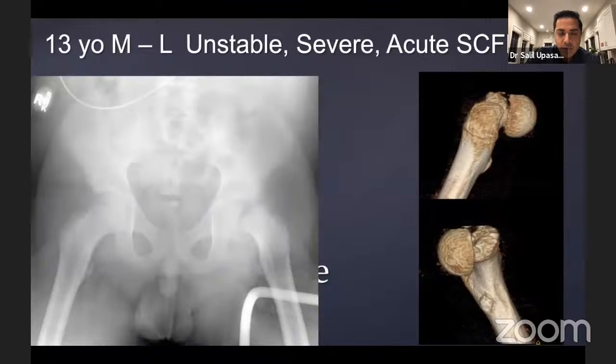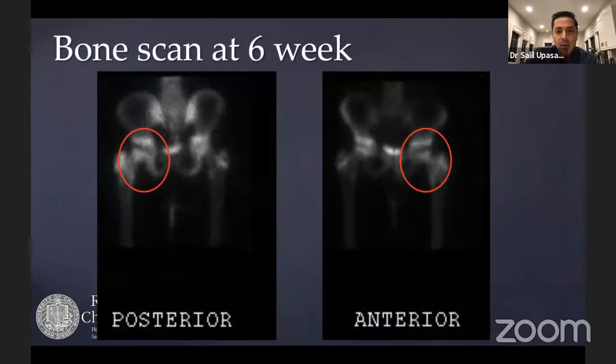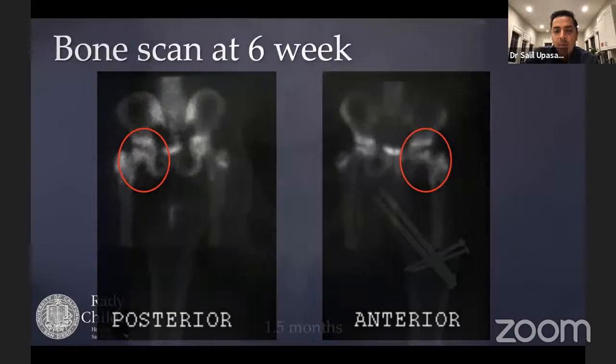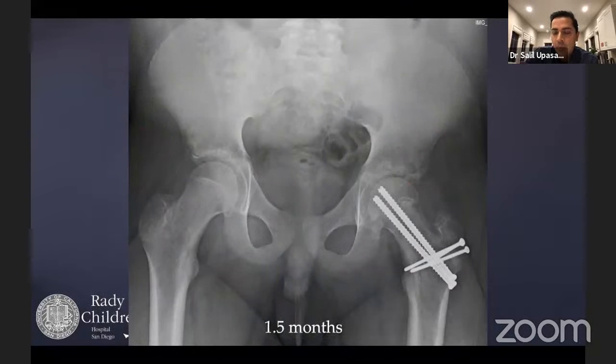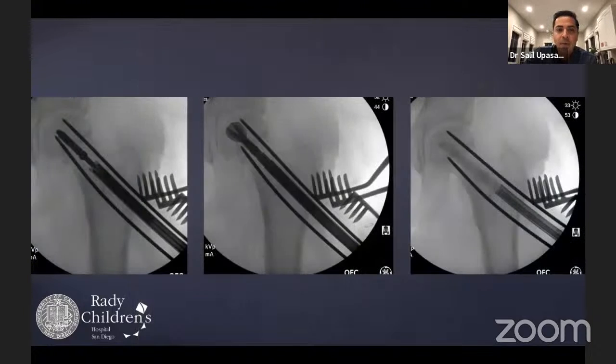I'm going to go through a case where that happened. This was actually in a SCFE patient at our facility. A 13-year-old male with a severe, unstable, acute slipped capital femoral epiphysis who was treated with the modified Dunn procedure, as shown here. On the 6-week bone scan, you can see the area of necrosis of the femoral epiphysis on that side. Again, before any collapse, as seen on the x-ray, you can see some screw penetration and an early sclerosis of the femoral head.